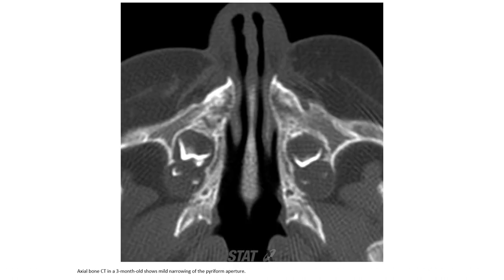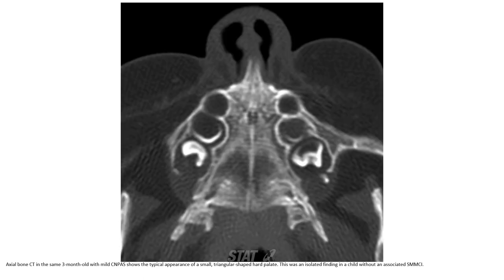Axial bone CT in a three-month-old shows mild narrowing of the pyriform aperture. Axial bone CT in the same three-month-old with mild congenital nasal pyriform aperture stenosis shows the typical appearance of a small triangular-shaped hard palate. This was an isolated finding without an associated solitary median maxillary central incisor.